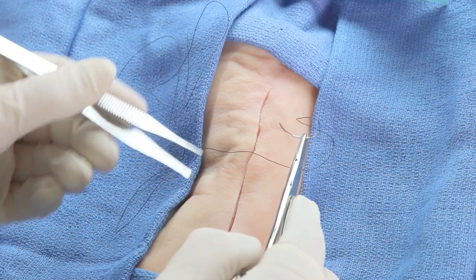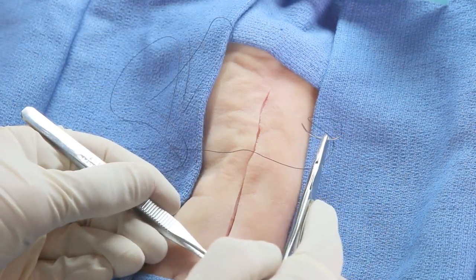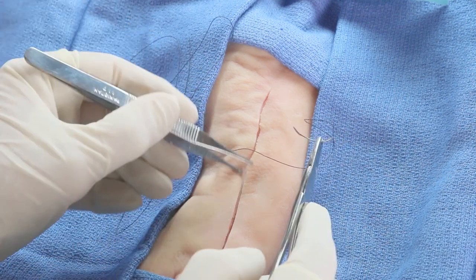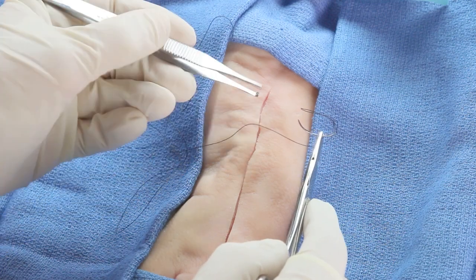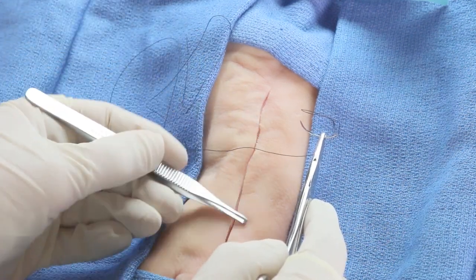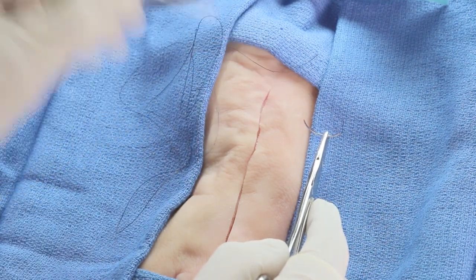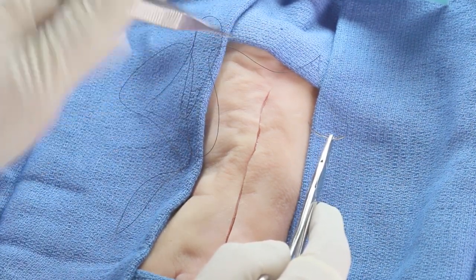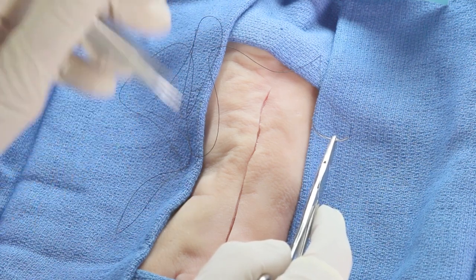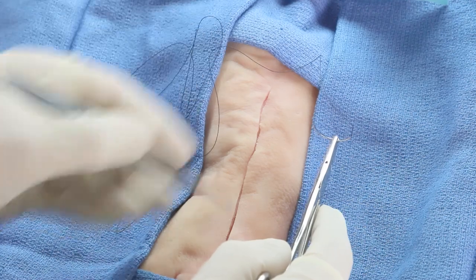Many closures call for starting on one end of the cut and going to the other. The off-grid medic, however, should place the first suture straight in the middle, and each suture placed is going to be independent of the others. These are called interrupted sutures. This allows the person who doesn't suture every day to keep an occasionally weakly placed stitch from unraveling the entire closure, as might happen in a continuous closure.